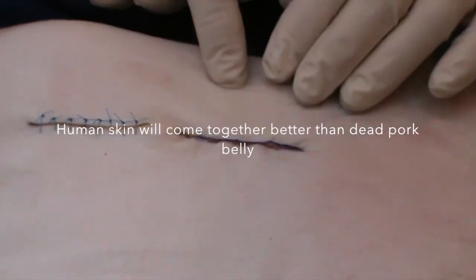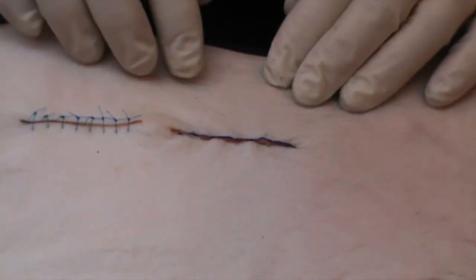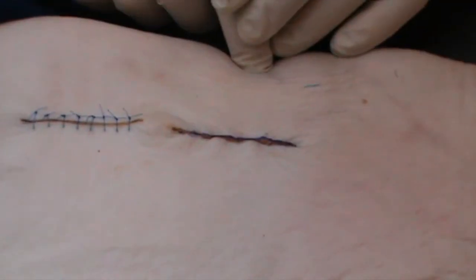Onto this I would be putting adhesive strips such as Steri-Strips to help support the wound.